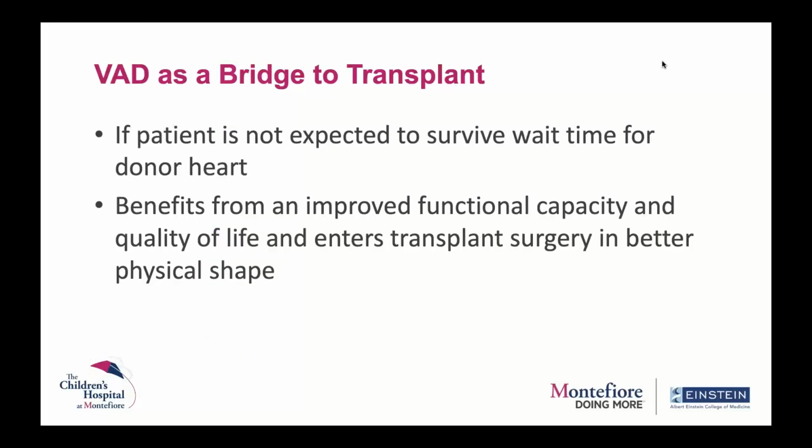So what do we mean when we say that we're going to use VAD as a bridge to transplant? So if we know that a patient is not expected to survive the wait time for a donor heart, we will be implanting a VAD as a bridge to transplant. The patient benefits from an improved functional capacity and quality of life and enters the transplant surgery in a much better physical and functional shape. And that is what we mean that we're going to be using VAD as a bridge to transplant.